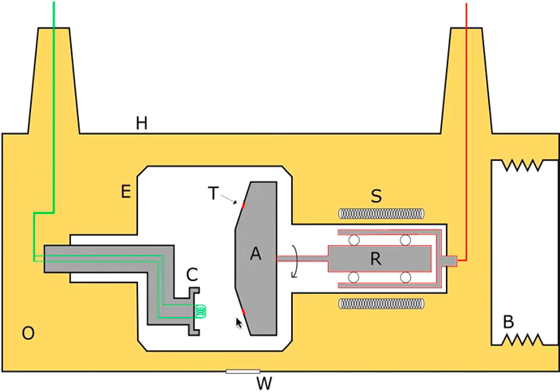When we talk about X-rays, we're really emitting photons, but we're generating them through electrons. We're going to talk more about that process later. I just want to focus now on the hardware.